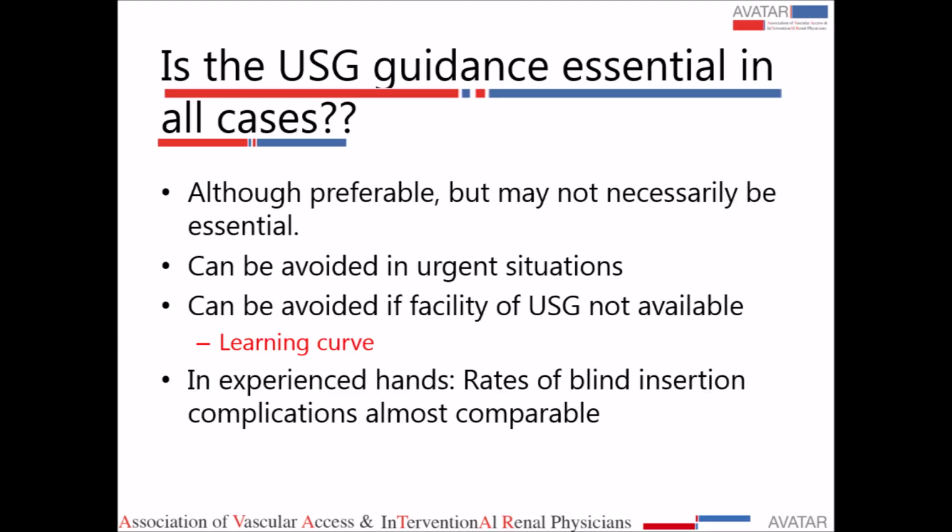But you have to remember that there is always a learning curve when we are learning with the help of landmark techniques or anatomically guided insertion. We all have a learning curve, and in the initial phases there will be an increased rate of complications with this landmark technique. There are a few reports that in experienced hands, the rate of blind insertion complications is as good as ultrasound guided, but this is only with experience. You can't start with the same rate of complications.